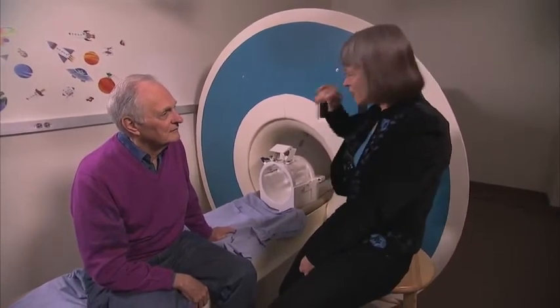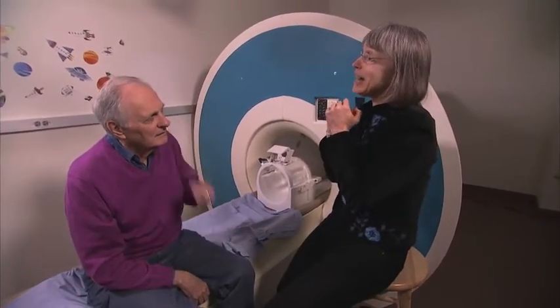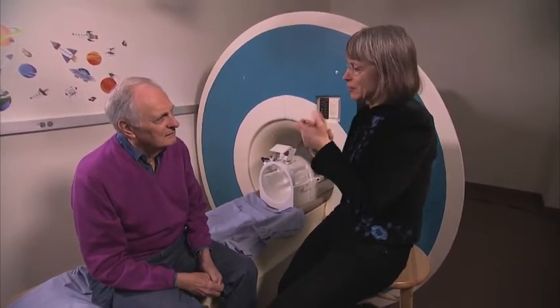Each bang that you hear during a scanning sequence is a little radio frequency magnetic pulse that we send in, like pinging on a wine glass. It reorients the hydrogen atoms in your brain, and the speed with which they come back to where they were is a measure of the amount of oxygenated hemoglobin in that part of your brain.